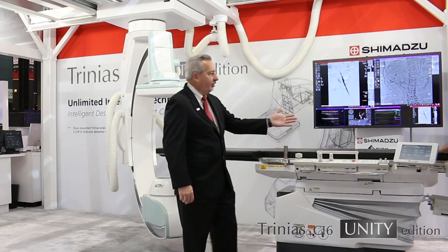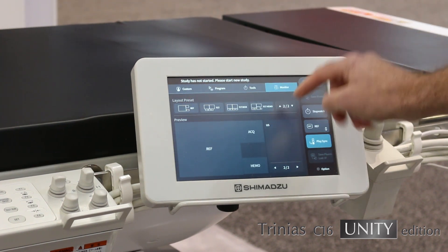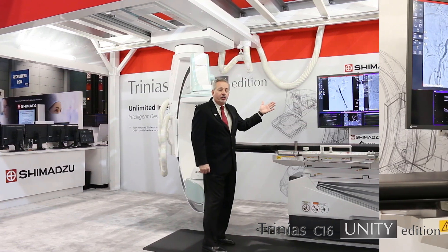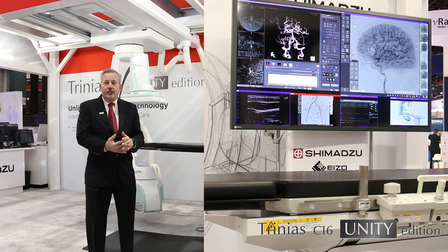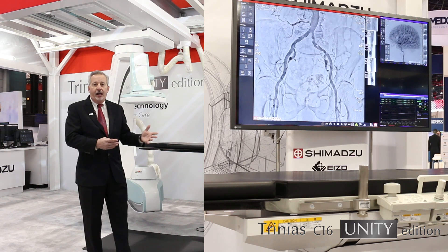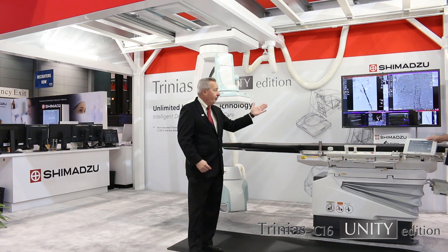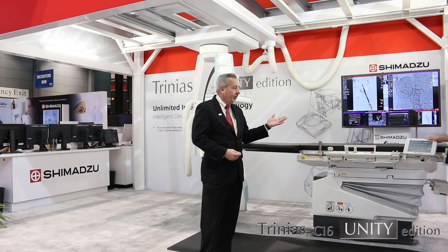The Smart Touch at the table side also controls the Smart Display. The large monitor has become a standard feature for many customers these days, with the ability to take up to 32 inputs at the table side. It gives you the ability to integrate other modalities and other images so that you're able to easily, at the table side, look at the functionality and compare images from a previous study with the study that you're working on today. It also has the ability to show ultrasound, hemodynamic imaging, and basically any image that you would like to put up there.